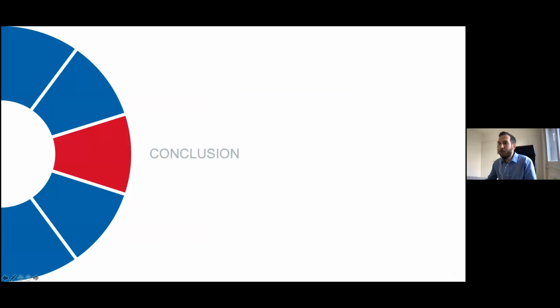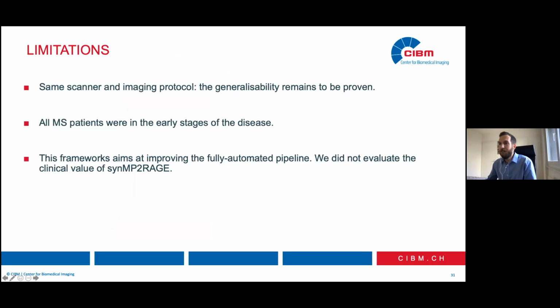So to conclude, first of all, some limitations which I would like to point out. First of all, we applied our framework to a dataset which was acquired with one scanner and using a single imaging protocol.